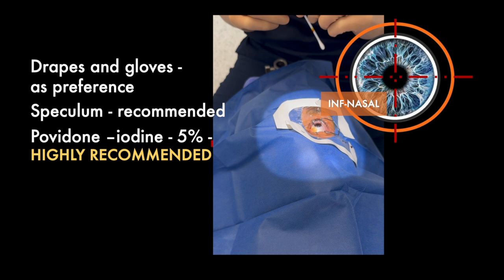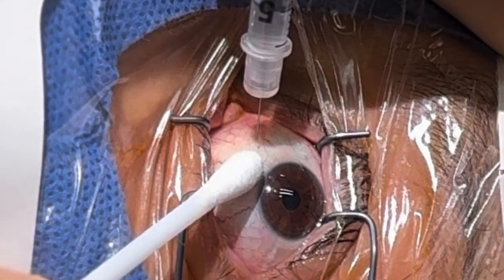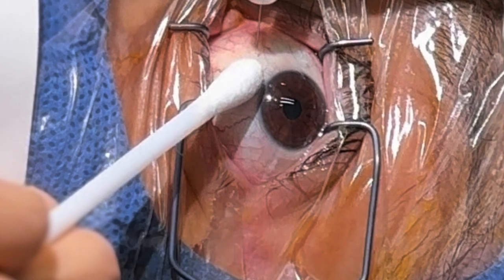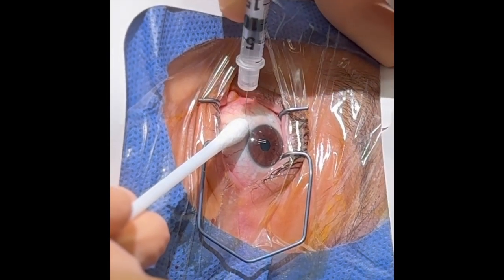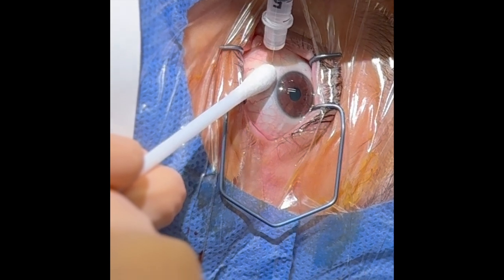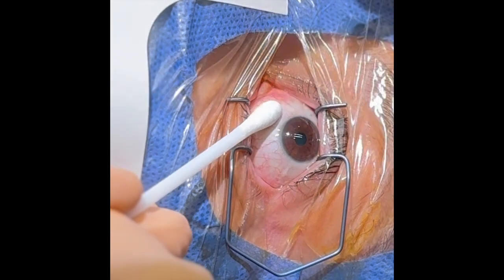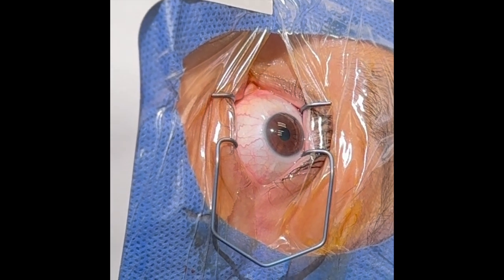Many patients also reflexively try to close their eyelids when the injection is going to be applied, and this causes them to move their eyes upward, causing major risk of contacting the cornea or maybe applying the injection closer to the ciliary body or the lens. That's why I don't like the upper quadrants. Now, to administer the injection, I direct the needle tip at a 45 degree angle from the horizontal plane of the crystalline lens, and then I aim the needle tip towards the center of the vitreous cavity. You can use a soft cotton tip to move the eye or hold the eye in position, and also to retract slightly the conjunctiva.